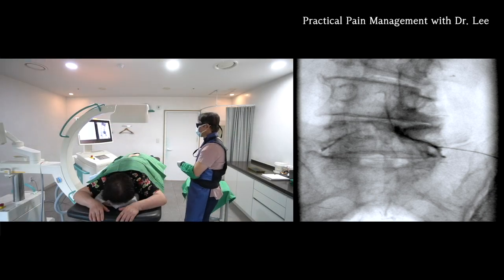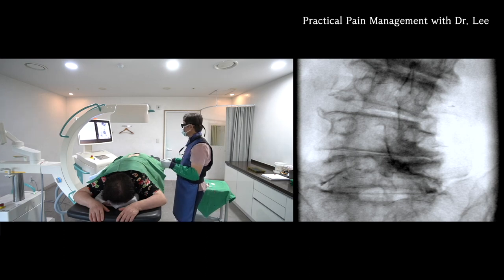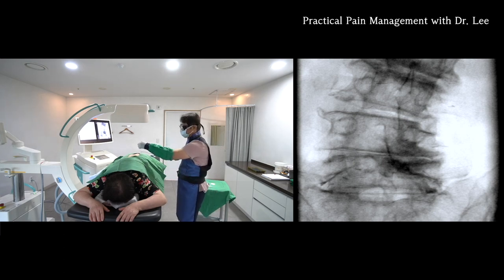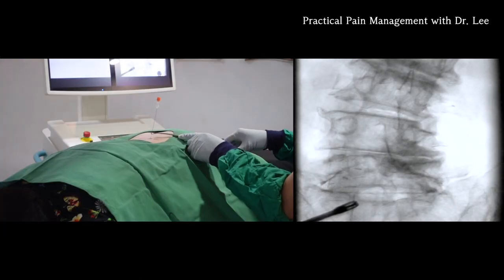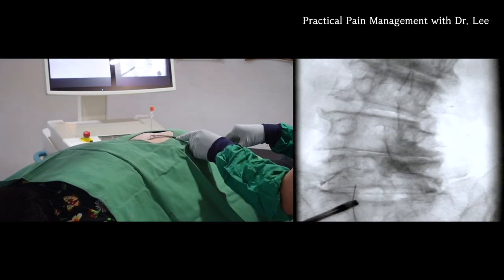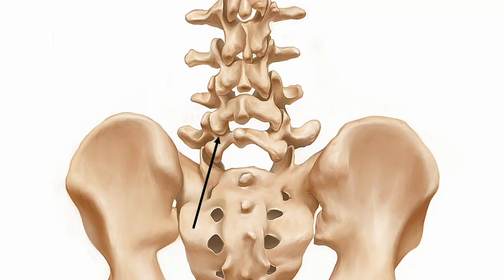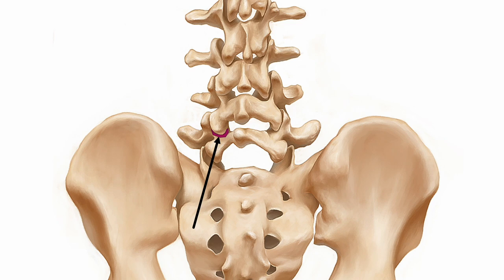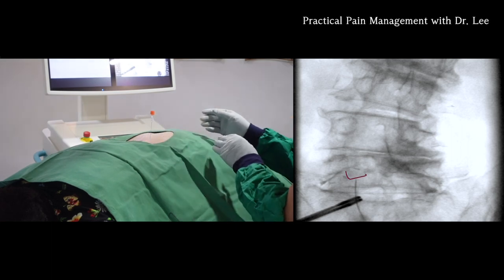There is central stenosis at the L4-5 level. Therefore, I want to add both L4-5 facet joint injections to facilitate the relief of compressive symptoms. To facilitate the therapeutic effect, I'll try to insert the needle into the inferior posterior recess of the left L4-5 facet joint first. The suspected inferior recess line is here.